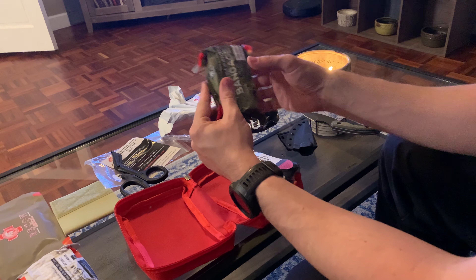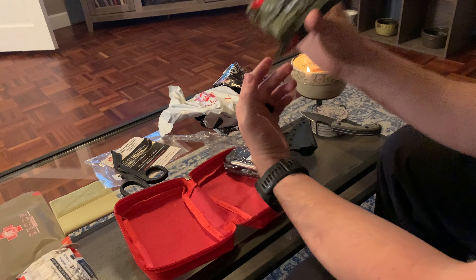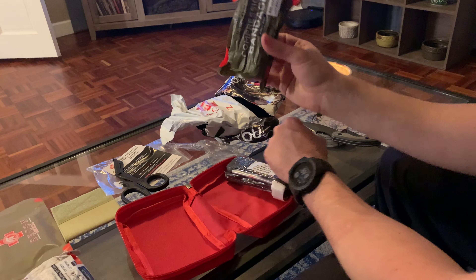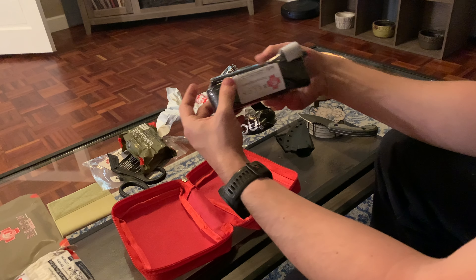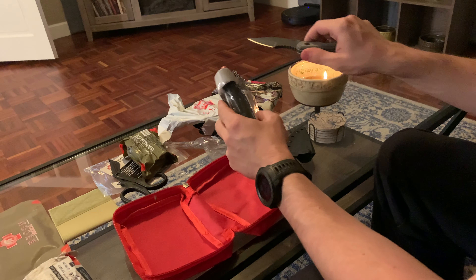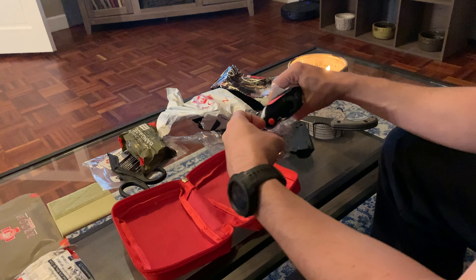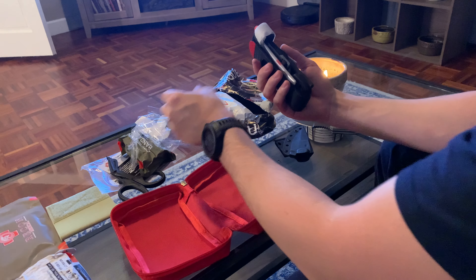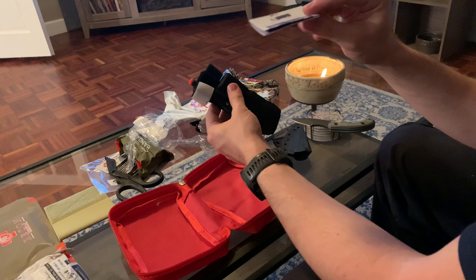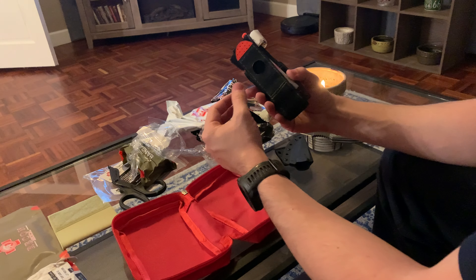We got a compression bandage, four inches — it's vacuum sealed. Hell yeah, that's perfect. It gives you instructions on the back. I always leave them sealed so I know what's what in my kits. I actually got bit by a German shepherd — it was a horrible experience — and I used one of these and it actually stopped the bleeding and kept me from getting an infection. These are great. Had my firsthand experience with them and they work perfect.